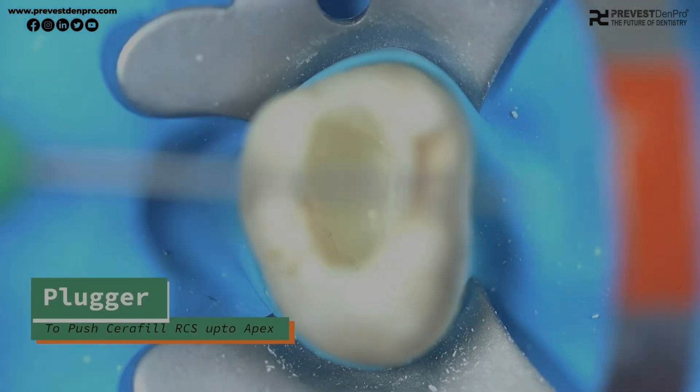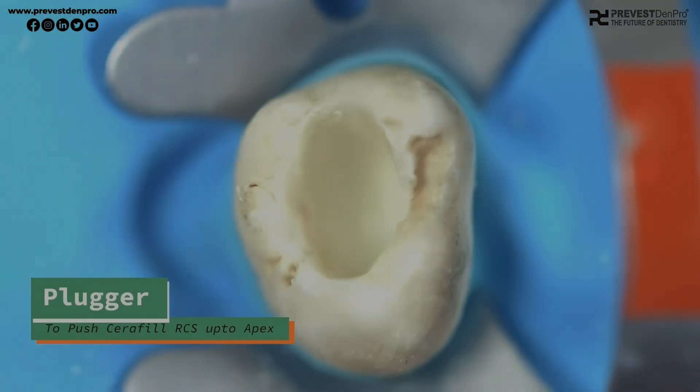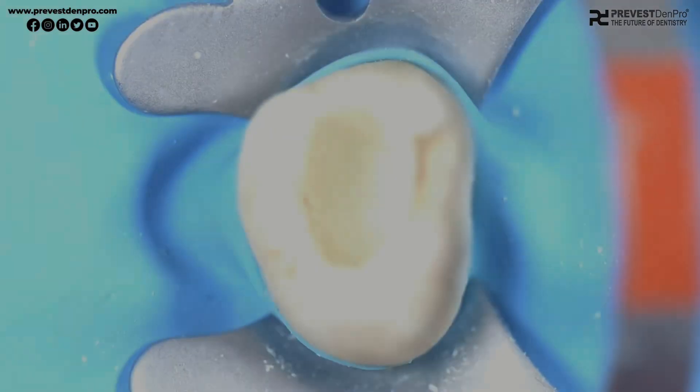In some cases, we may need to use pluggers to push the material up to the apex. We can use those pluggers to push the material to the apex or to the desired depth.